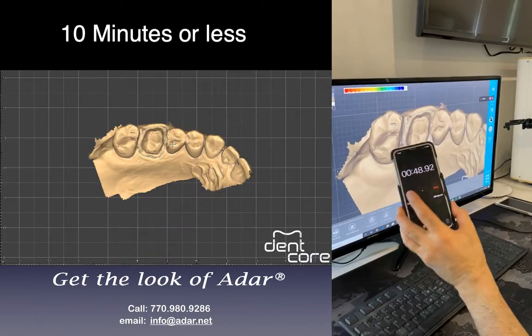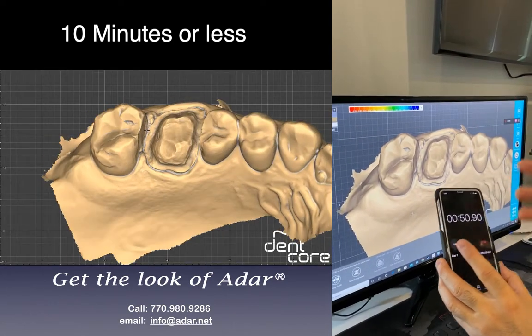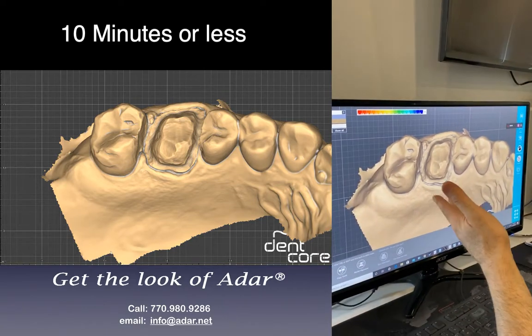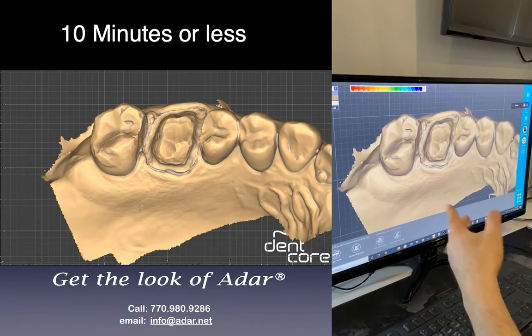I'm doing a single unit crown and I'm on timer. I want to do 10 minutes or less, because last week I did about an hour and 10 minutes. So I got rid of one hour.